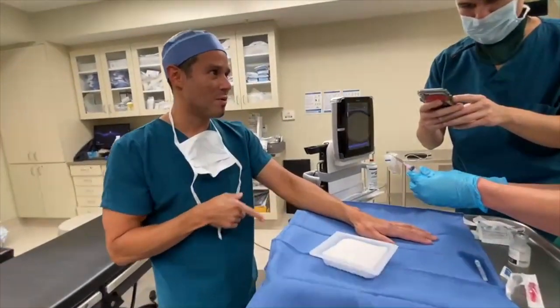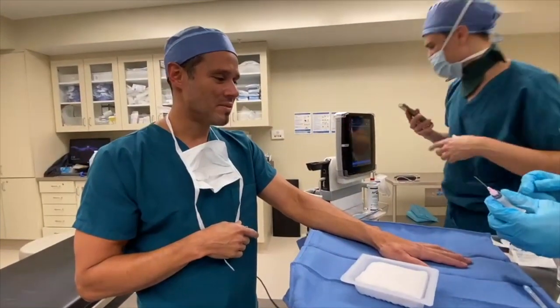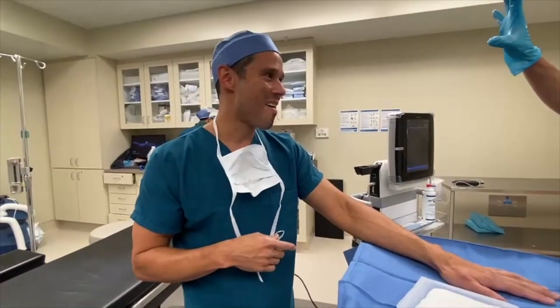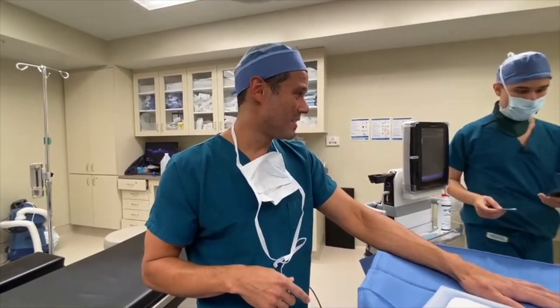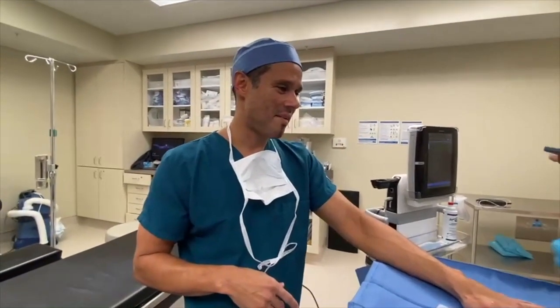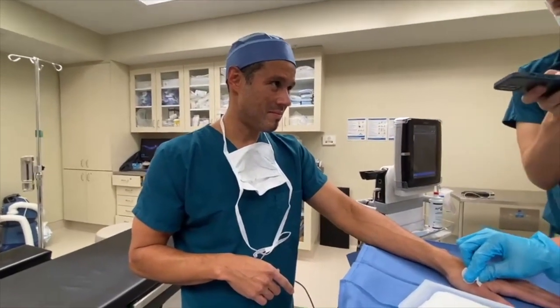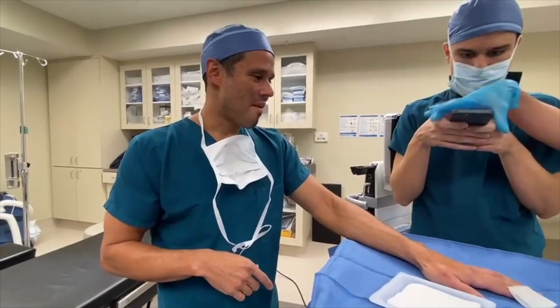It's a big one here. Lidocaine's fast — I need some more alcohol. Always film horizontal, not vertical. Okay, you ready?